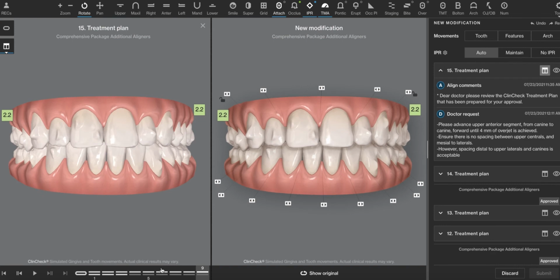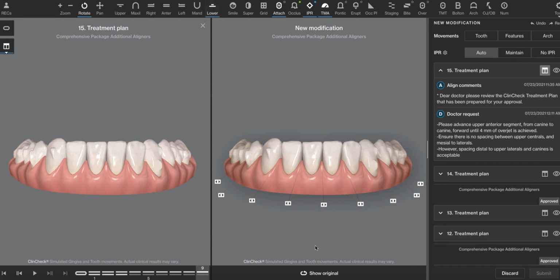Lastly, I would ask for them to always have the number of trays equal out. If you're going to have the patient wear trays, you might as well have them be active trays. What can you do on the bottom while the upper trays are being done?